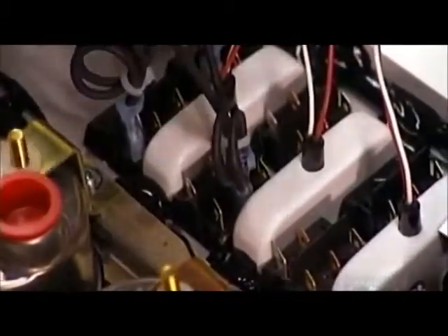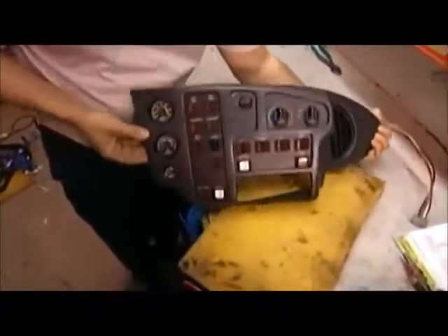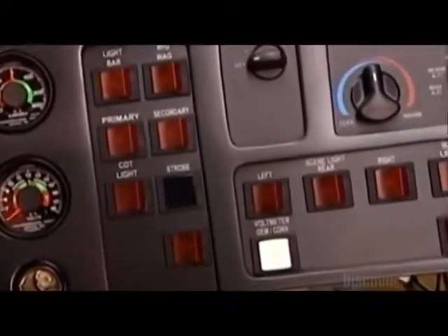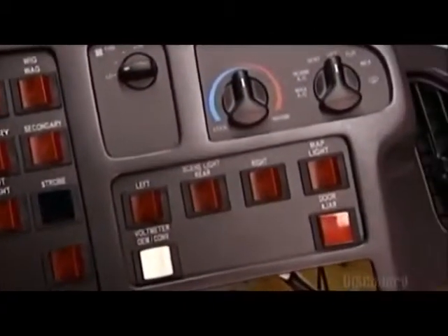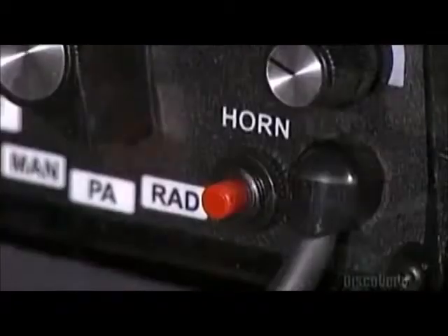Now they assemble the front console, an array of buttons and switches that control all the non-medical equipment, such as the emergency lights, the siren, the headlights. There's also a battery life indicator and other system gauges. Once assembled, the console goes into the dash, and workers test everything out.